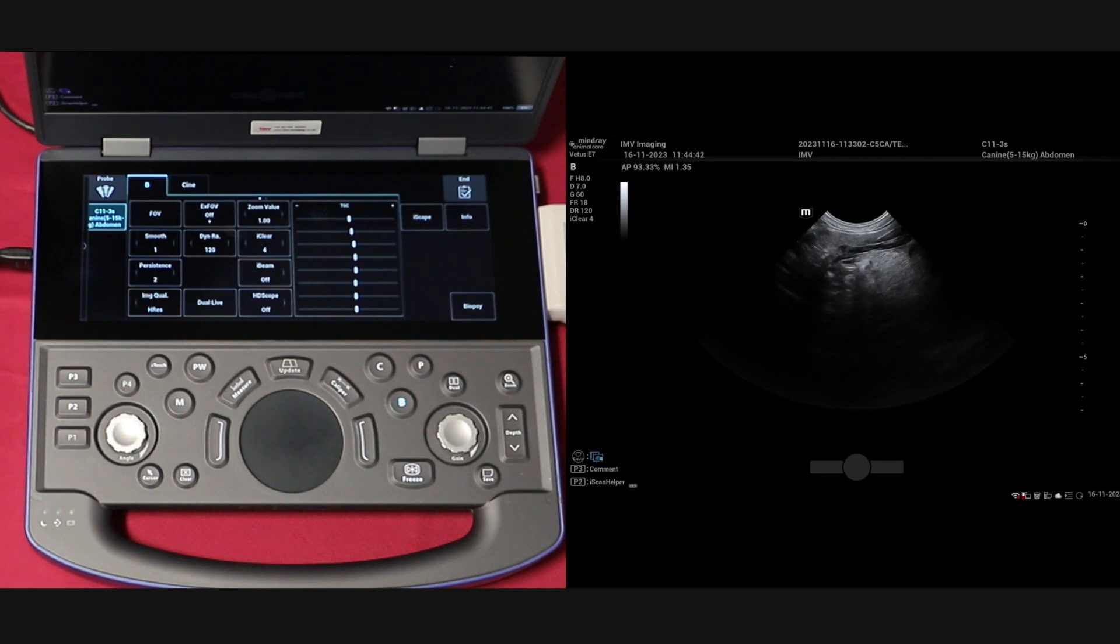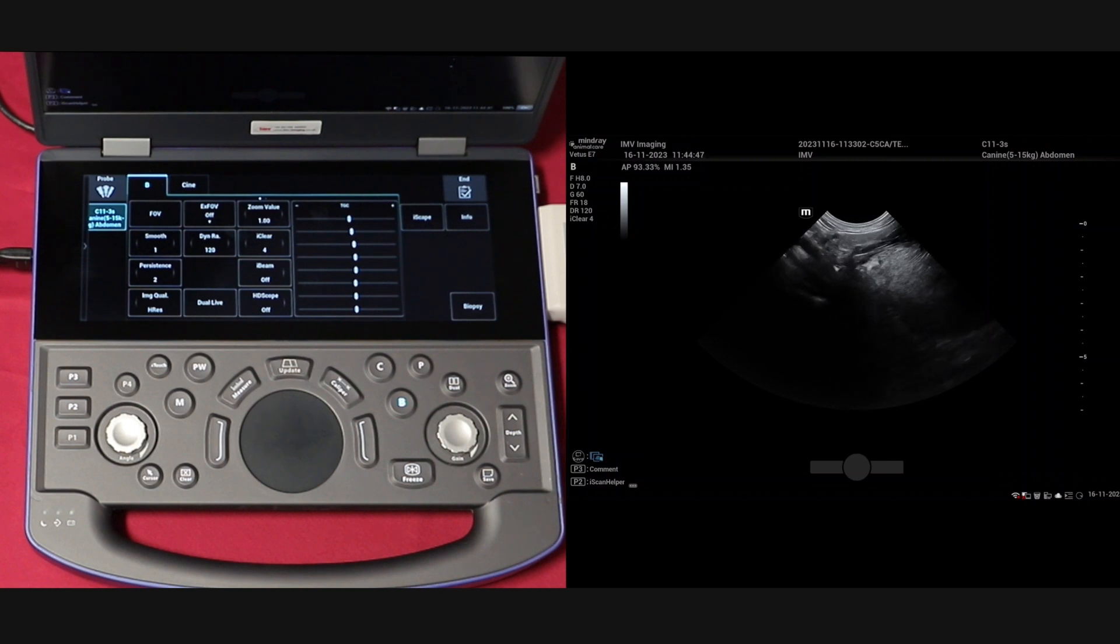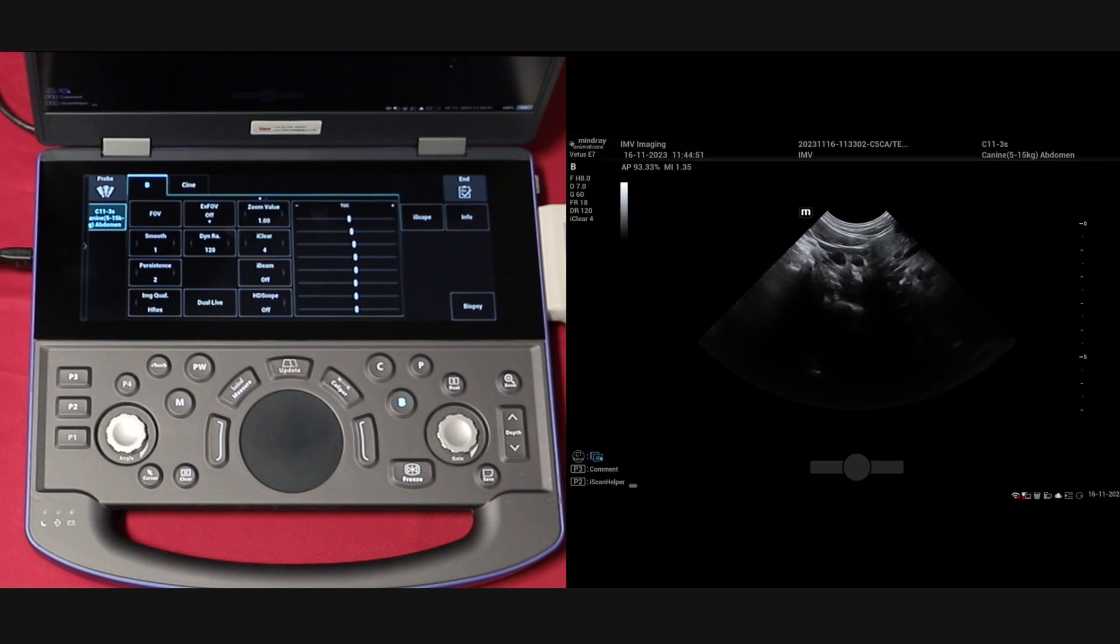There is no option to adjust the focal point on this system. Instead, it uses focal zone technology that optimizes this for you based on your selected preset.